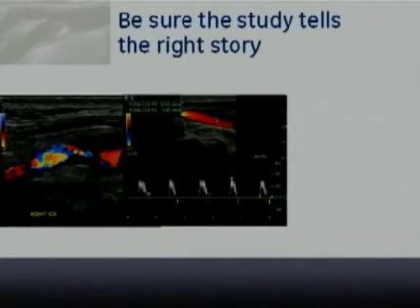Next, when she sampled in the common carotid artery, it looked like a very high resistance waveform and low velocity. It looks like the angle correction is good, but she's sampling in the middle of the vessel, but not in the middle of the flow. So I really feel like the sample location is not correct. It should be in the middle of the flow. And the image is so dark that I really can't appreciate whether or not there's plaque in this area, which there was.